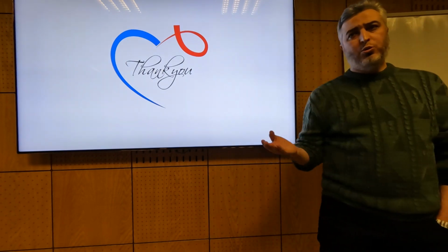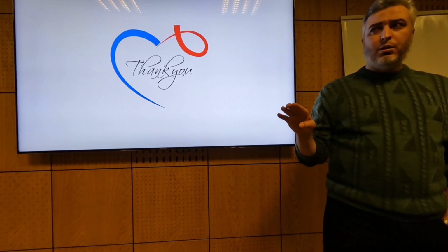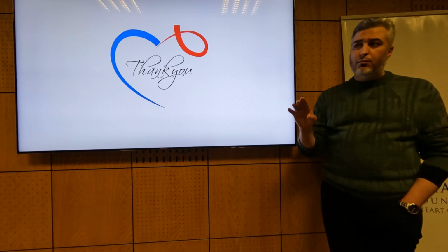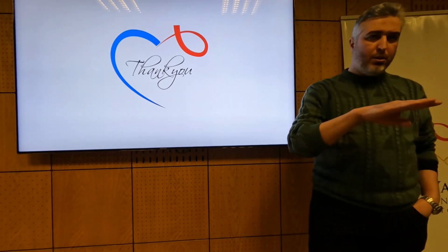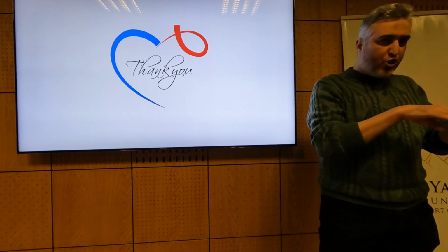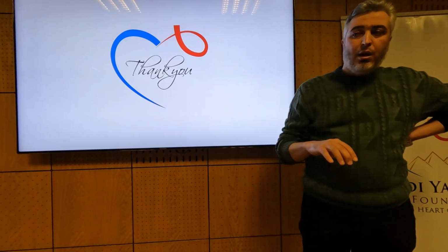Also, by the way, what would you do if a patient is going to surgery with a permanent pacemaker on? At first you check if the patient is pacemaker dependent, and whether he still has an escape rhythm, even if low. Before starting the operation, we change the mode into VOO or DOO, just VOO, with a rate that is significantly higher than the patient's own rate, so that you do not run into the VF scenario.